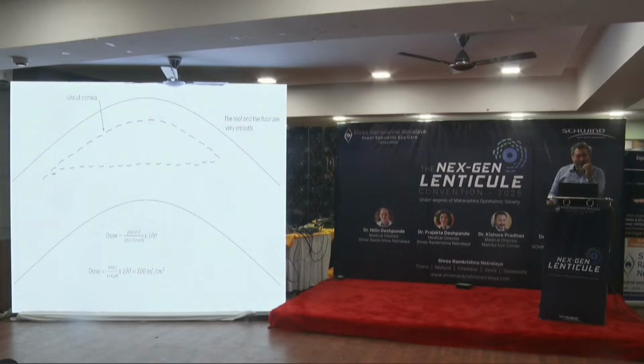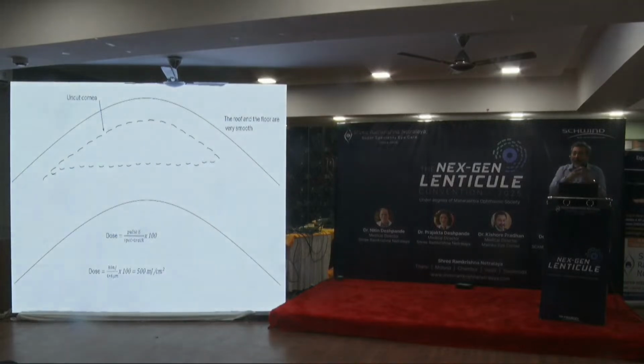You could have very, very low phaco energy, but tomorrow your cornea is white. Nobody knows why. My phaco power was so low, and everything was so easy, but then your time is so important, the phaco time. So the whole amount of energy that is going into the cornea is so important. So you see, we've done bad things in our life, to actually understand what to do next.